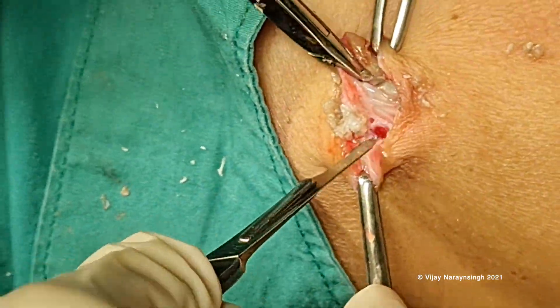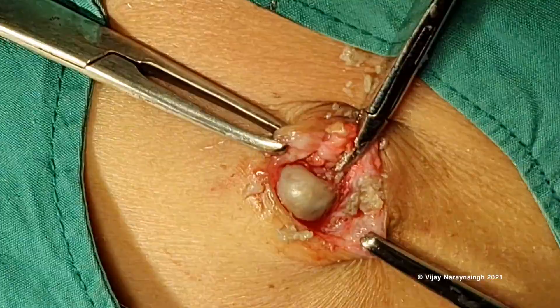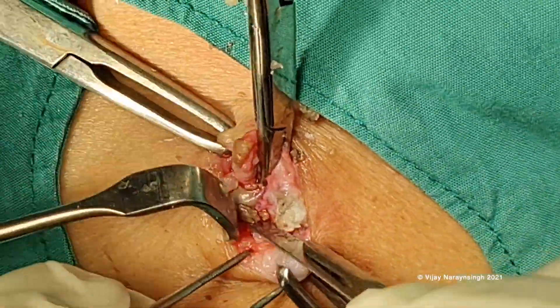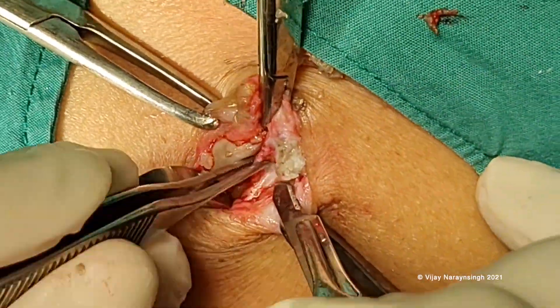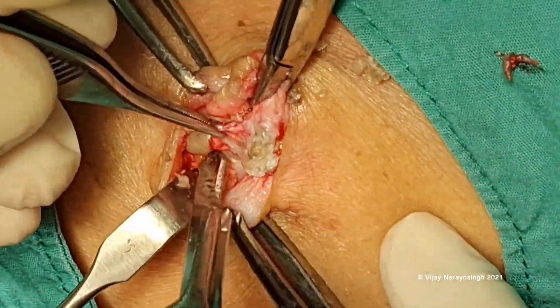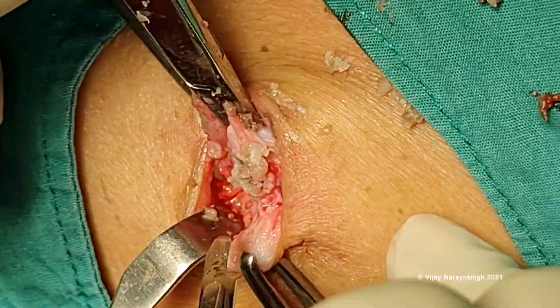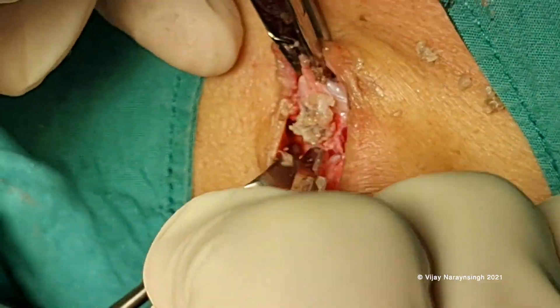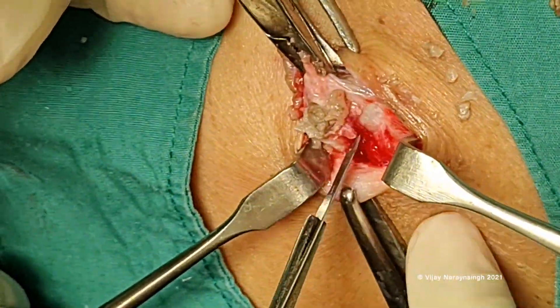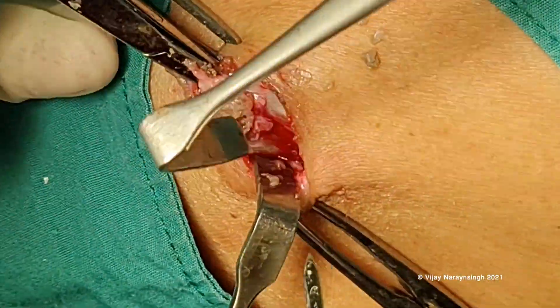So for thin walled cysts, continue the dissection lateral to, and around and deep to wherever a rupture occurs. Thin walled cysts do require this particular technique, and we can still ensure a fairly complete cyst excision.